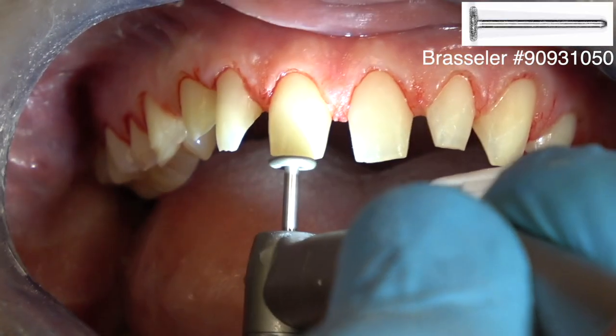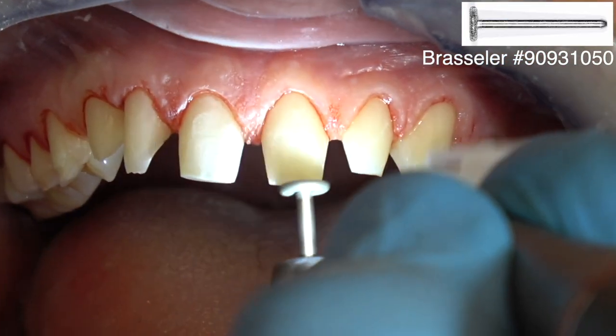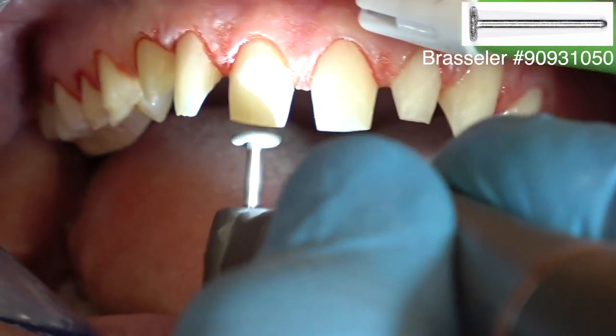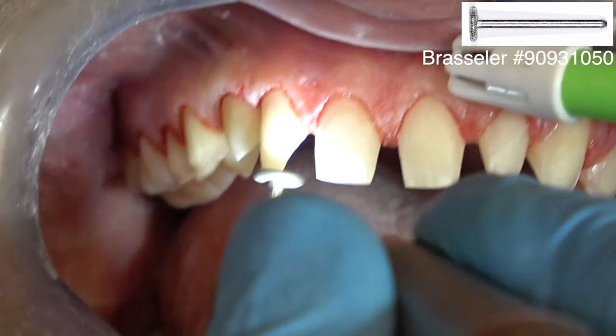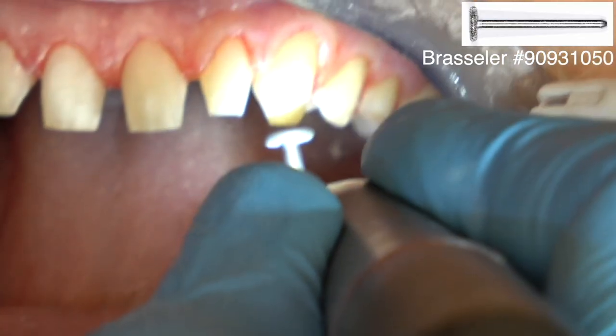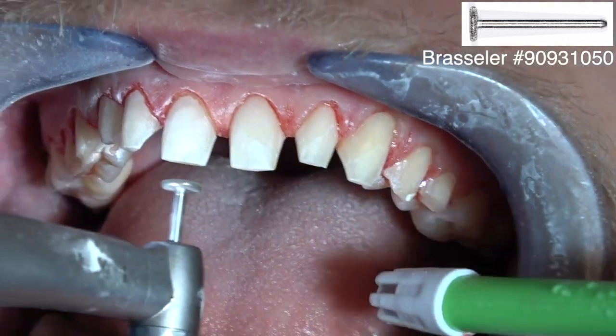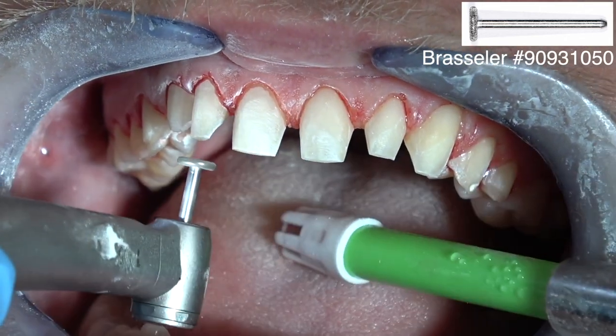You want it to be a 90-degree angle at the incisal palatal line angle. All the studies show this is the most favorable preparation for many reasons, and I go through it in that video on wrapping. This is not original to me. Dr. Monnier and Douglas did the studies and came up with this method.